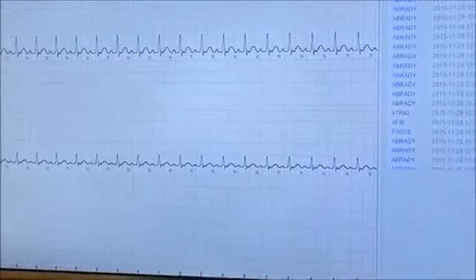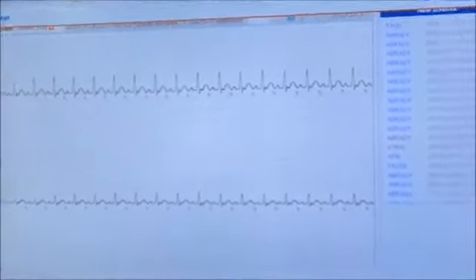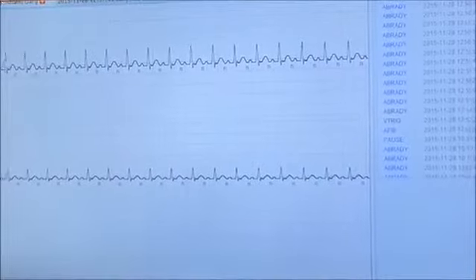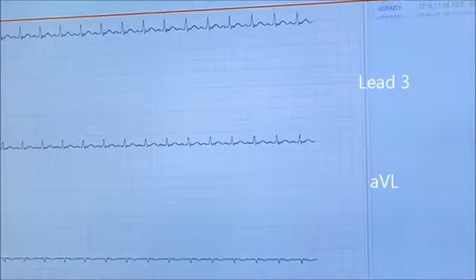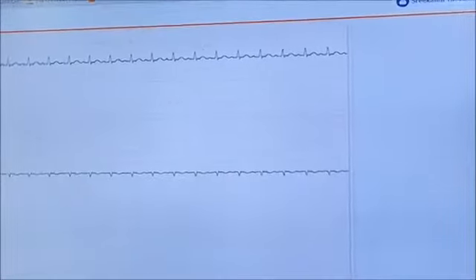So now this was data collected from the simulator. Now we will collect it by connecting it to the body. So here you can see all the 8 channels can be seen on the cloud live.